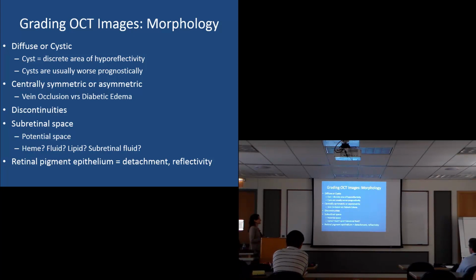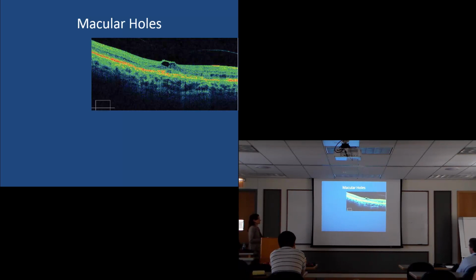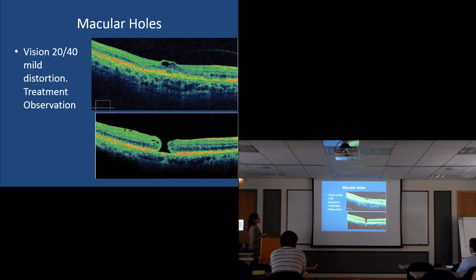Subretinal space becomes very important, and this is probably where we lose our specificity. So this disease, macular hole, is really changed by OCT. As you can see, this patient has a macular hole. Even our classification, our wording of it, is completely different now that we can actually see what layers it's affecting, because face on, this looks the same as this.